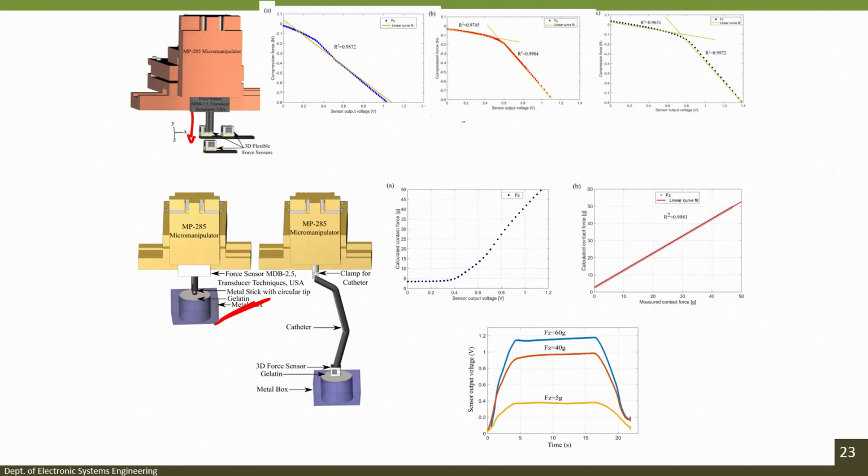So, let me show it to you here if it is too confusing for you. If I have the commercial force sensor CF, and this is the fabricated force sensor FF, right. Now, what I am showing you here is, let us say there is an electronic conditioning circuit. Every time the resistance changes, let us keep resistance as a point. Now, I am applying different forces, 0.1 to 0.4 Newtons. This is the commercial force sensor applying force on the fabricated force sensor.